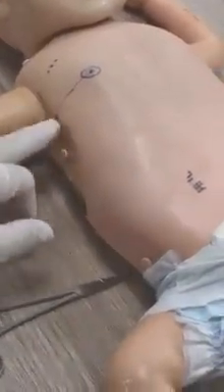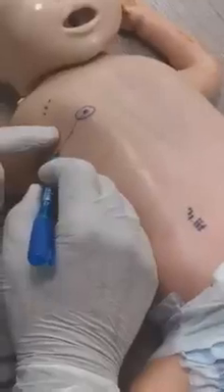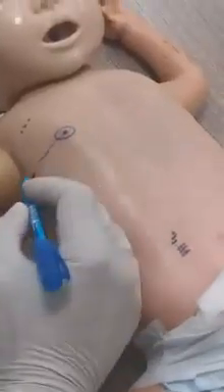Before I go in, this is the site where I will take the incision. I prefer to take a transverse incision. So my transverse incision will be like this, along the skin crease. I don't prefer to take it long, but I prefer to take it on the transverse line.